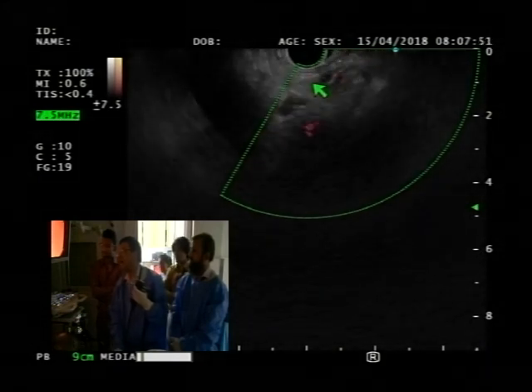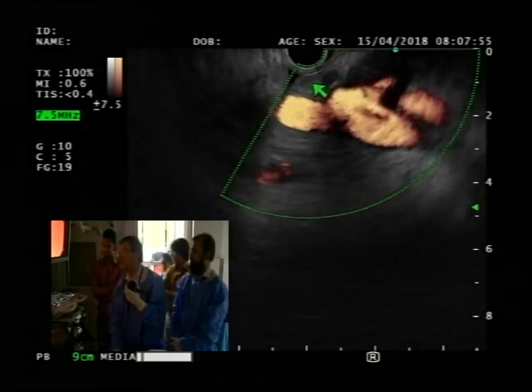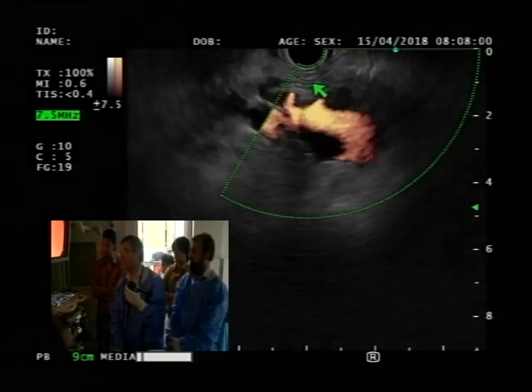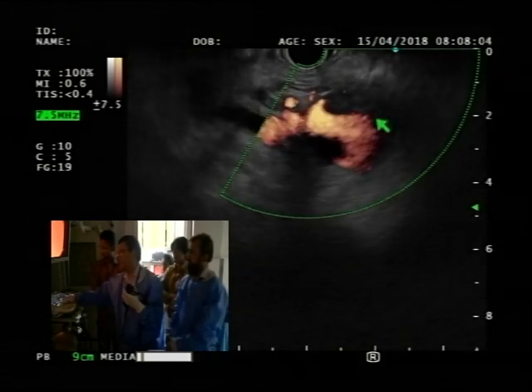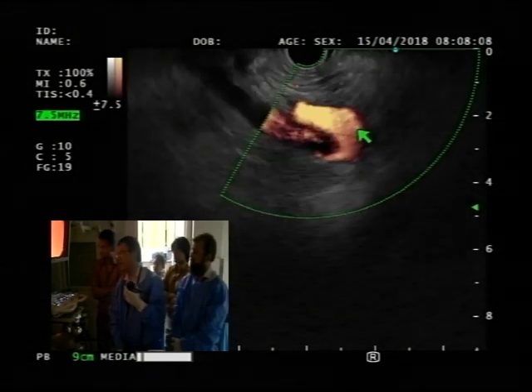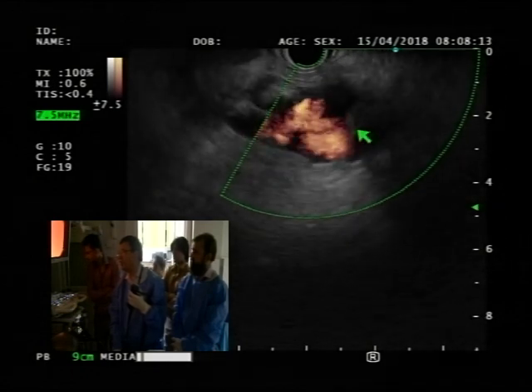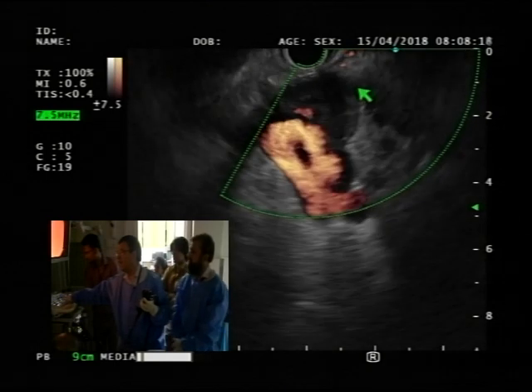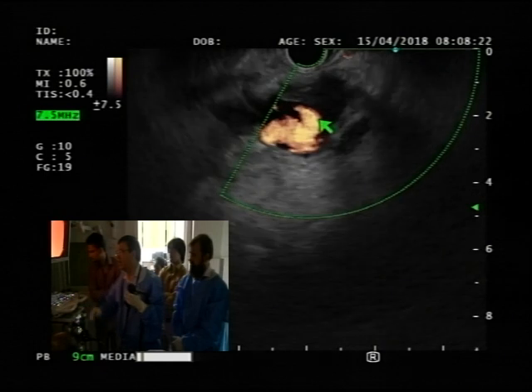So that also is very worrisome in a way, that indicates likely that there is a mass in the head of the pancreas, secondary to the tumor, and you see a lot of vasculature there as well. So it's possible it's portal vein thrombosis? Correct. Yes, exactly. That's the possibility we need to keep in mind. So here we do see a SMV. You see a little bit of pancreas above that, but some of it is maybe even a thrombus in there.